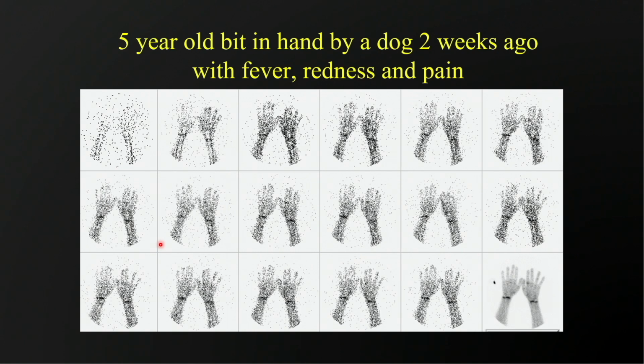And so when we do any kind of study in terms of nuclear medicine for infection, usually the first study that we do is a 3-phase bone scan. And there's 3 parts to this. The first part is when the technologist injects and we get imaging over the first minute, and that's usually called a flow phase or angiographic phase.